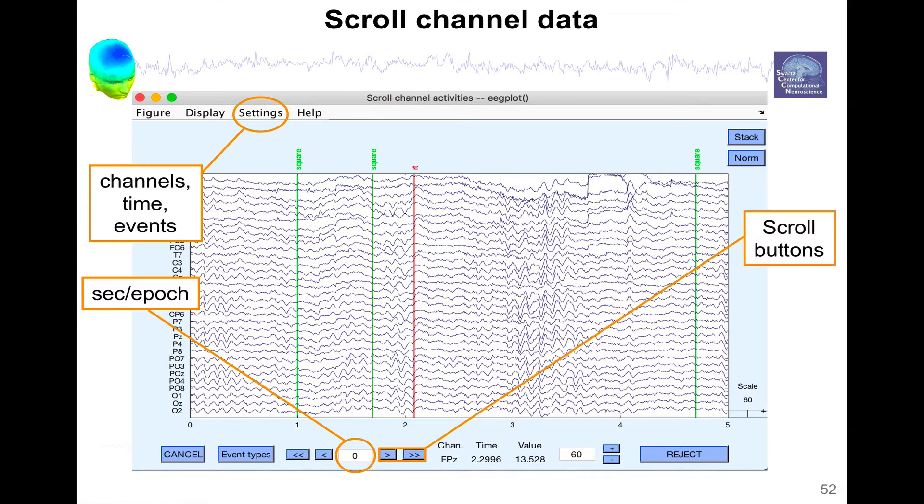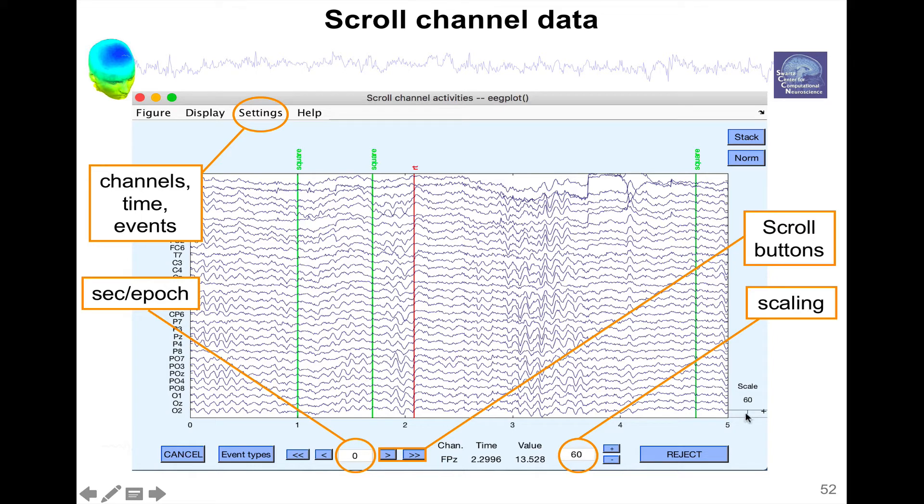These buttons are for scrolling back and forth. This is the button for scaling, so you can scale the EEG up and down, and here is the scaling, the scale shown here.